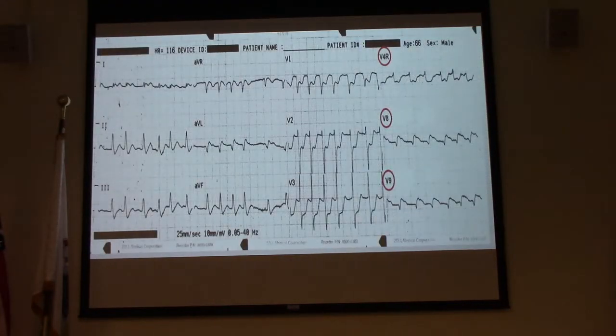If you're doing a posterior wall, if we take a look here, in V1, V2, V3, we all had ST segment depression. Okay? We could suspect that someone might be having a posterior wall. We move V4R, and then we move V5 and V6 to V8 and V9. And we have elevation on those leads. That means this patient is having a posterior wall MI. And like I said, 50% of all of our STEMIs are missed due to posterior wall MIs. Even the hospitals a lot of times forget to go ahead and do them. They end up in the cath lab.